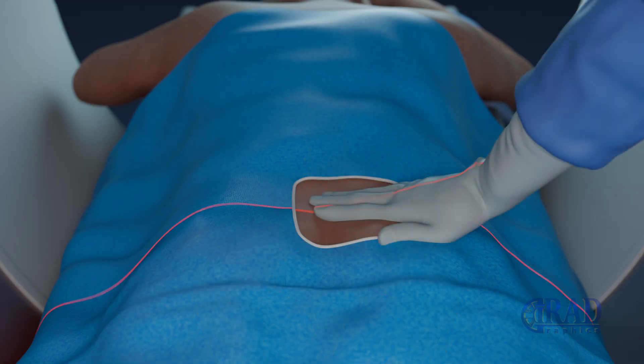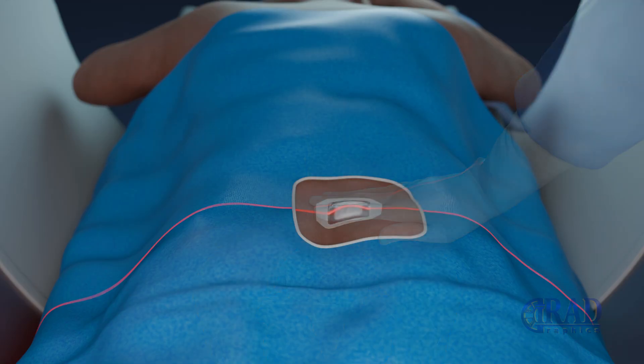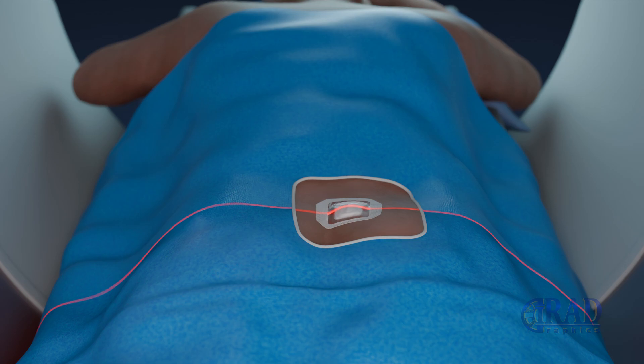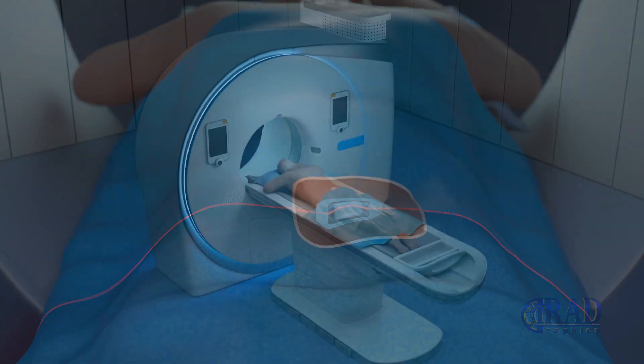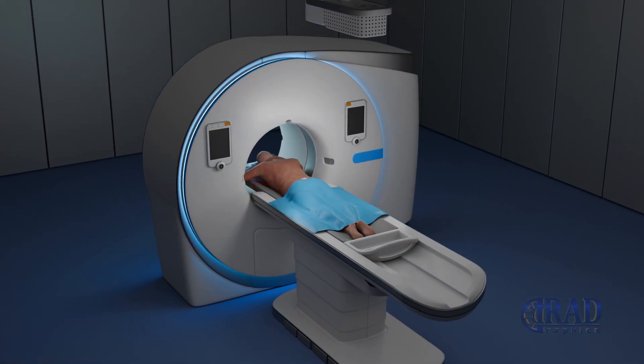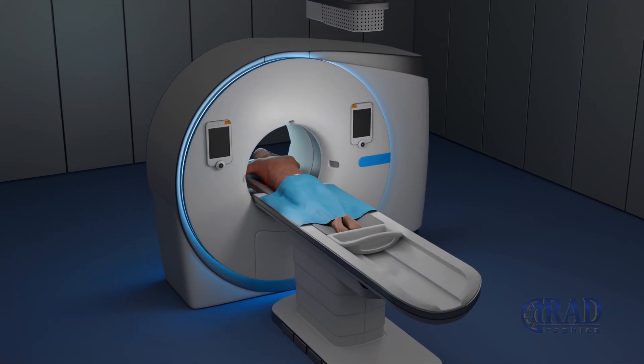At the end, a sterile dressing is applied at the access site. A final CT scan may be taken to check for complications such as hematoma formation.